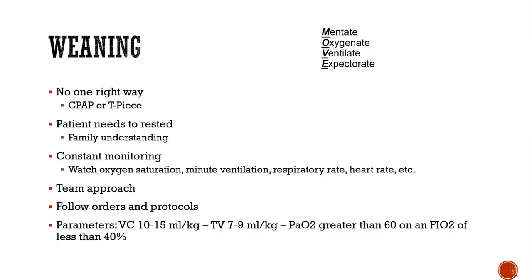And then we also obviously want to constantly monitor. It's a team approach. You've got to be involved. The provider's got to be involved. Respiratory's got to be involved. Therapy's usually involved. It's a very collaborative effort. Make sure we're following our orders and our protocols, and then make sure that our parameters are being followed.